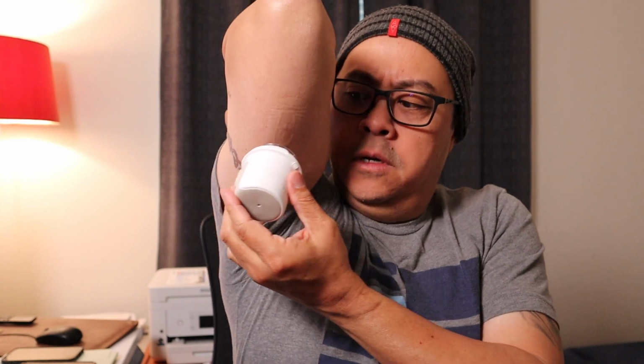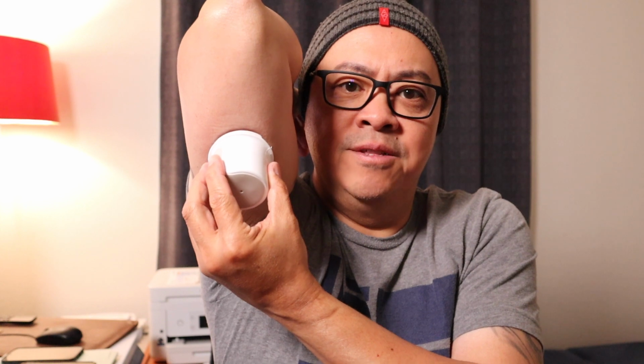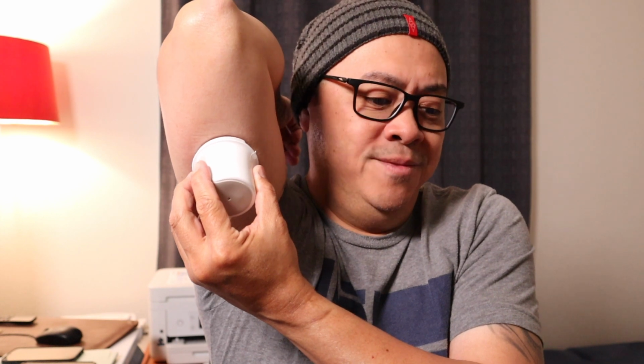So we have our G7, first time using it. According to the instructions, you unscrew this portion right here, the cover, and it also tells us not to touch the inside part. Everything is in there, as you can see. So we're going to choose an area to place it. I'm putting it in the same general area as my last one, but let's put it in there. It said press firmly, and then we just press the button. The G6 was relatively not painful. I'm not sure about this one, but here we go.